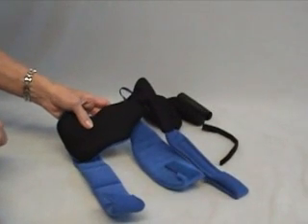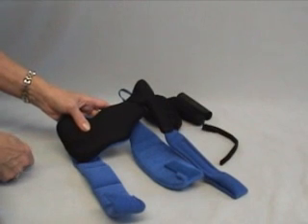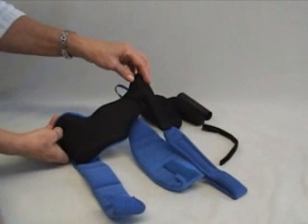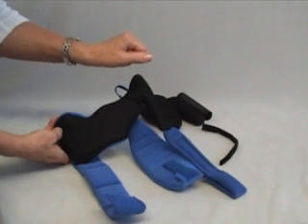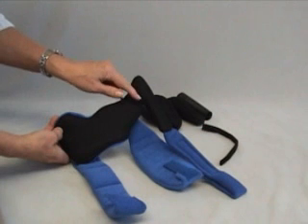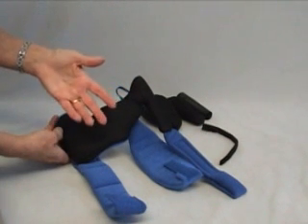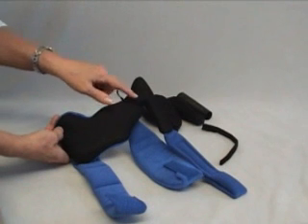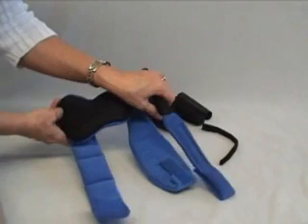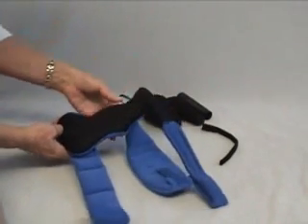This is the Neuroflex Restorative Flex Hand, commonly referred to as the Flex Hand. You'll notice the design makes it very efficient for addressing those very tightly closed palms. It's also very effective in patients like someone with end-stage Alzheimer's to work through the tone at the wrist. It's very common to see them work through the tone with a tight fist and then the fingers start to relax.